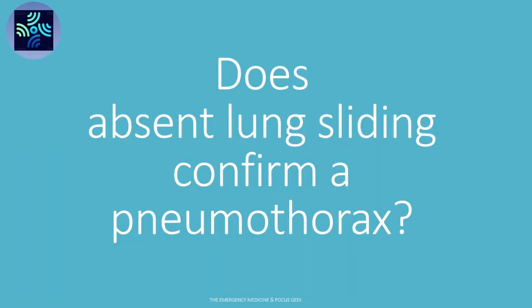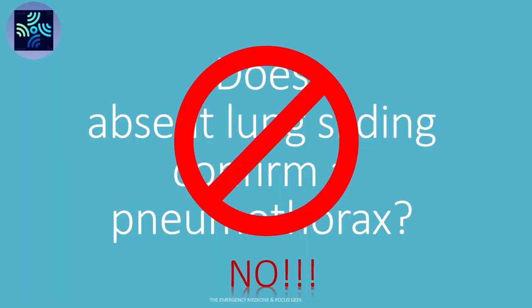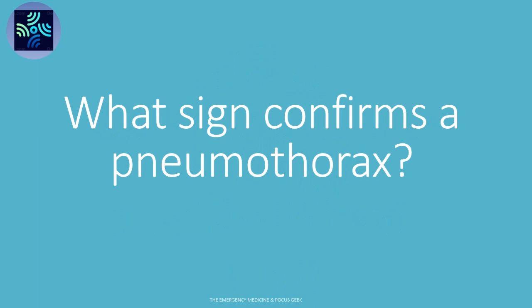Does absent lung sliding confirm a pneumothorax? No. There are many other differential diagnoses for absent lung sliding. What sign confirms a pneumothorax? If you see a lung point, that is 100% specific for pneumothorax.